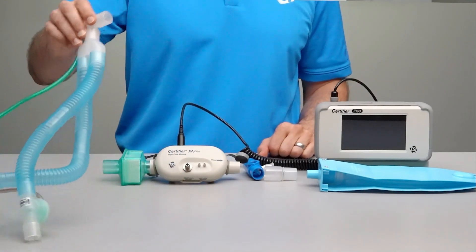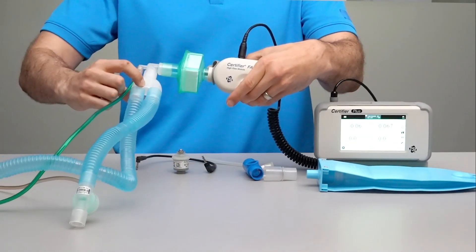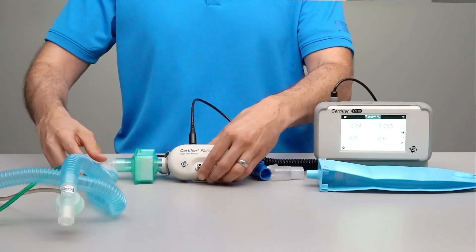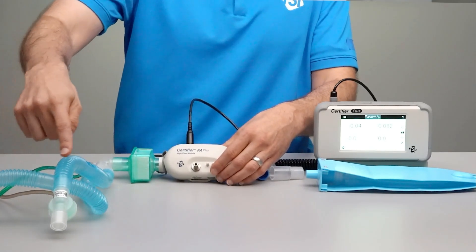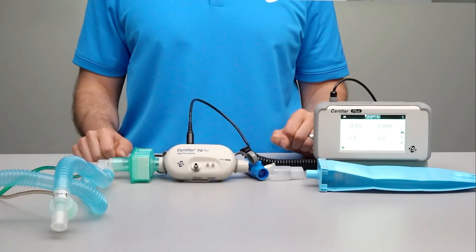Install the high flow module into the test circuit with the Y fitting upstream or on the inlet side of the flow module. This corrugated tubing is used to carry inspiratory and expiratory flows from the ventilator and then back to the ventilator.